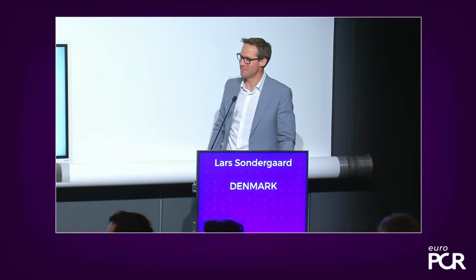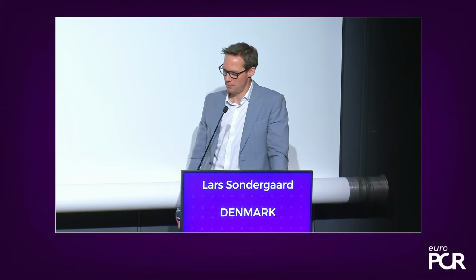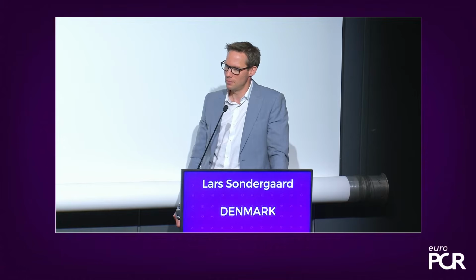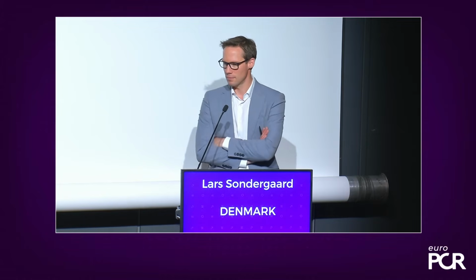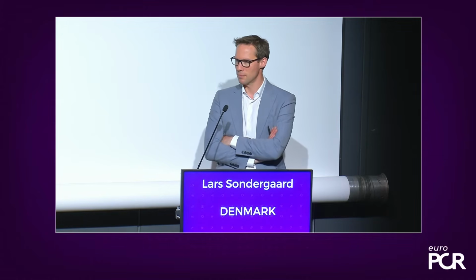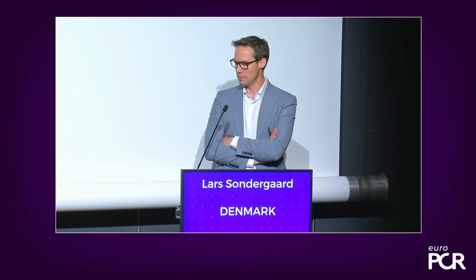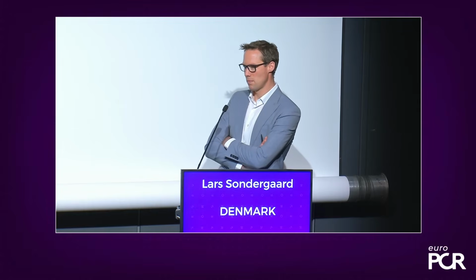Thank you so much. Concerning the fact that this session is imaging for structural heart disease, and you show the CT scan imaging, as we all know, these images should be EKG gated, and the patient with structural heart disease generally has AF, and there is some problem in getting a low AF rate to get the best picture so we can decide about the LA auricle, or even in TAVI cases.